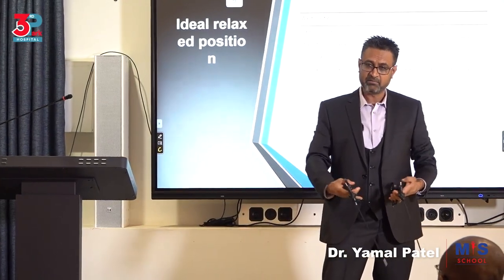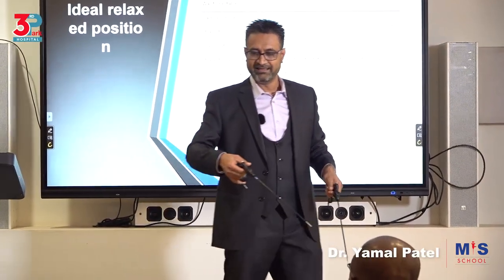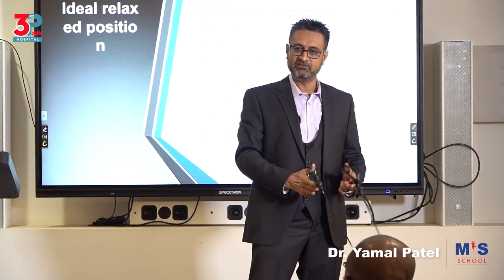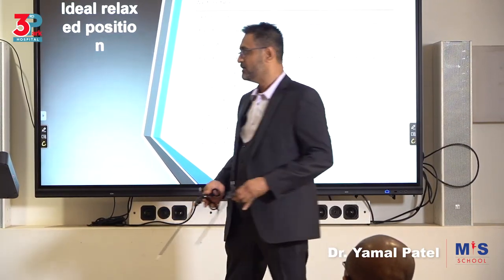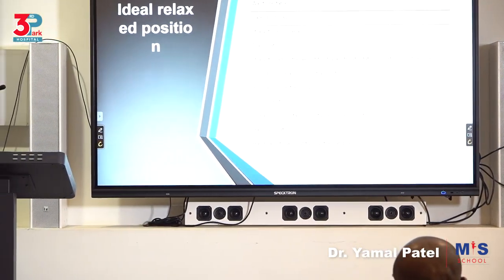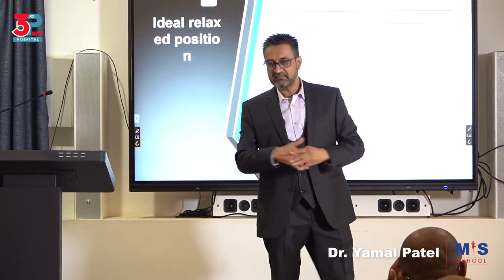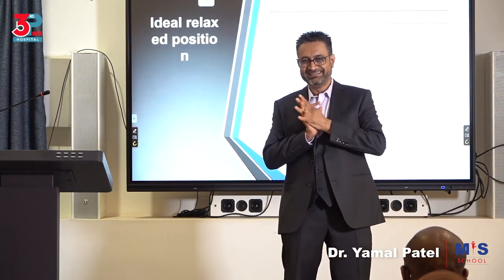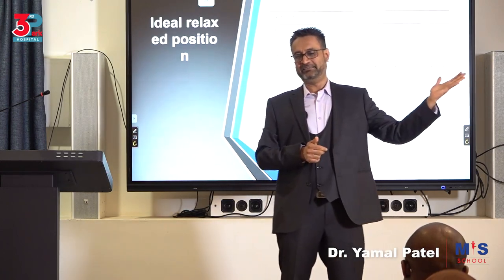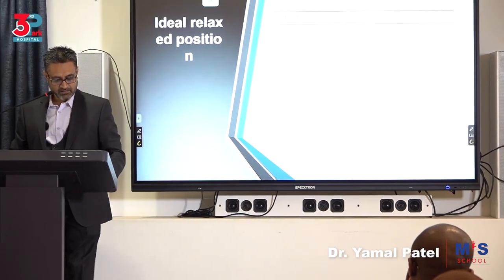Whether you use in-grip or over-grip, it's up to you. Over-grip is good for long, prolonged positions. So if someone is doing retraction, over-grip. But otherwise you can do an in-grip, okay? So you have to make sure that is all followed in those rules. If you use that kind of an ergonomic ideal stance, I would say you can operate for hours and hours without getting tired. You can suture for hours and hours without getting tired. Otherwise, one case is enough to make you tired.